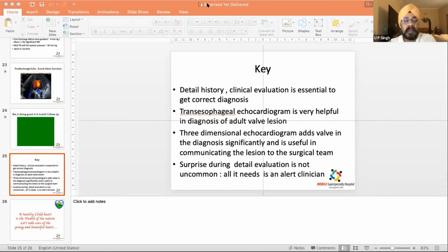Dr. Momin wants to comment about the same patient, I presume. He said it was done in 2 sittings. The patient with the ASD and the PS with the bidirectional shunt is doing well, but RV diastolic dysfunction is progressive. The PPG across the pulmonary valve is 25 only. So whether some diastolic RV dysfunction is in place, that may be the reason. In long-term pulmonary stenosis, there may be some RV thickening and dysfunction. I presume that should be the case.